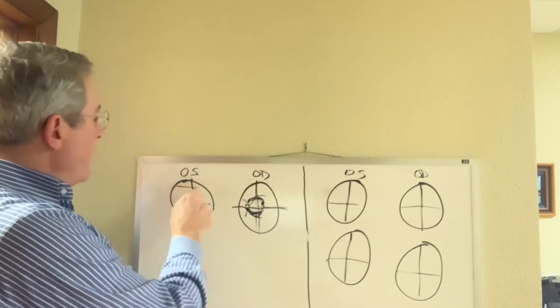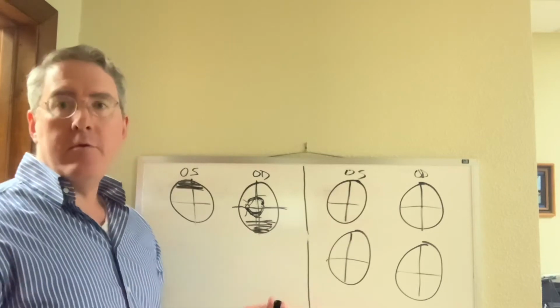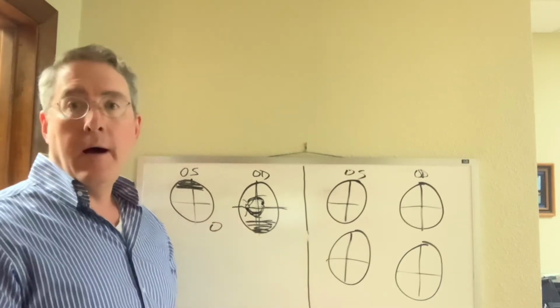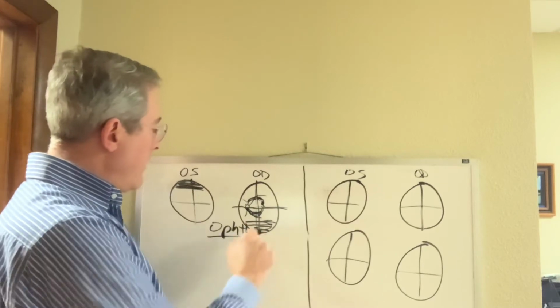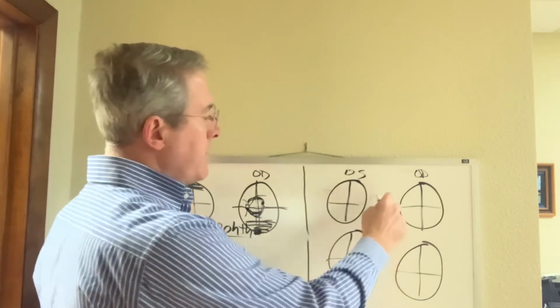So you'll get a visual field defect kind of like this, or like this. Any of those defects, those people need to see an ophthalmologist. That's an ophtho-consult.